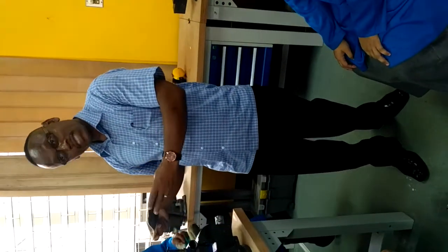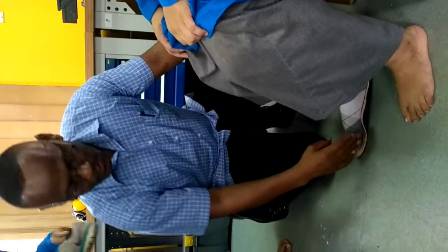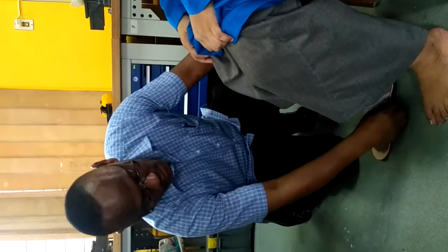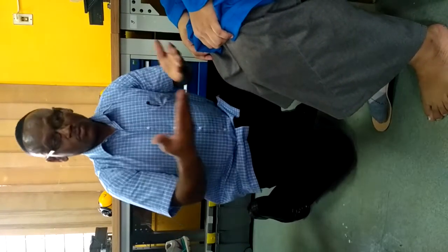In this direction, similar situation again. Patient care — sit down. Introduce yourself: I am going to do fitting for my project. Sitting position — the same thing I have explained. In the sitting position, you are going to look at the contour, or the fitting of the device in the foot. You are also going to check the trim line. So that is done. You can also ask the patient to do loading, standing, static. Ask how the patient feels in the standing position. You can also check the alignment from the coronal plane.